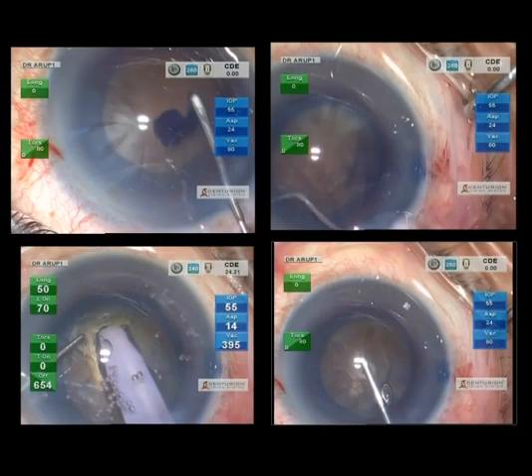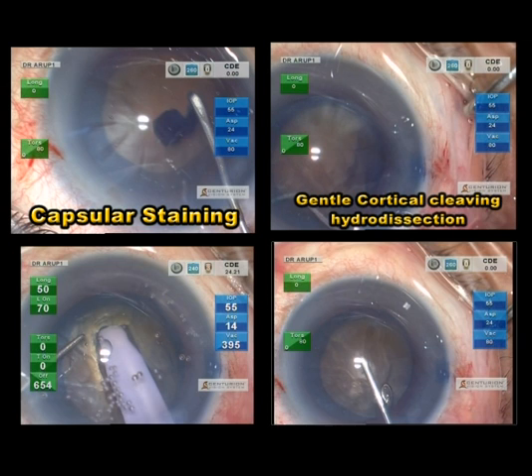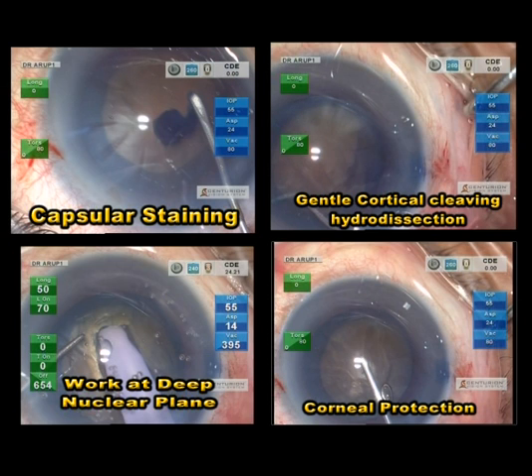In summary, capsular staining with trypan blue is important for capsule consciousness in order to prevent capsular damage during various maneuvers. Cortical cleaving hydrodissection should be performed very gently and at multiple quadrants to prevent capsular blowout. We should work at a deep nuclear plane for debulking as well as nucleus disassembly. Corneal protection is paramount especially in harder cataracts, by repeated replenishments with a dispersive OVD and working away from the corneal endothelium.